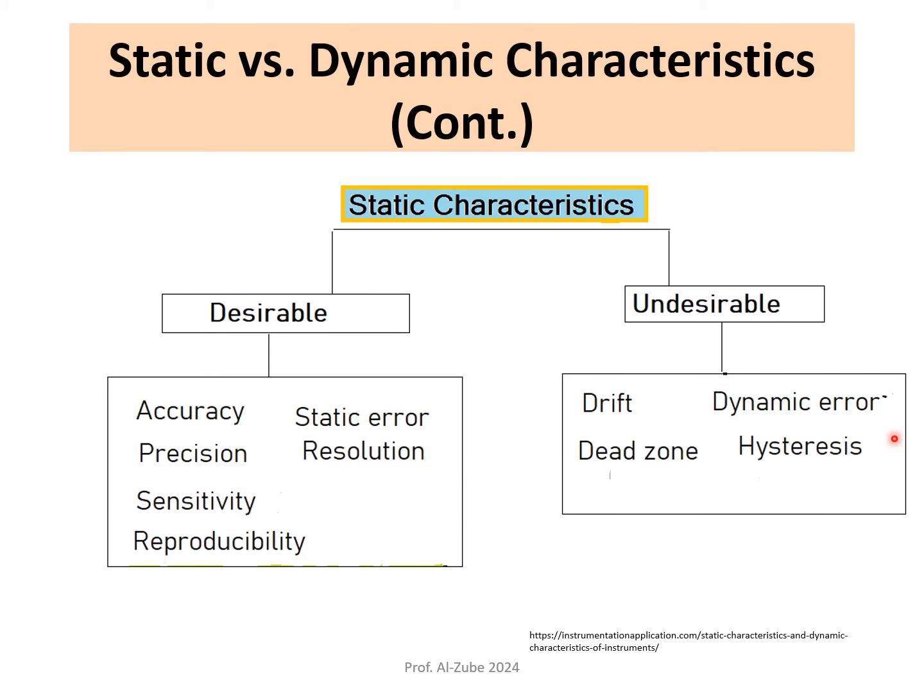Now we have something called hysteresis. Hysteresis is the lag in the response of an instrument when the direction of the input or the stimulus is changed.